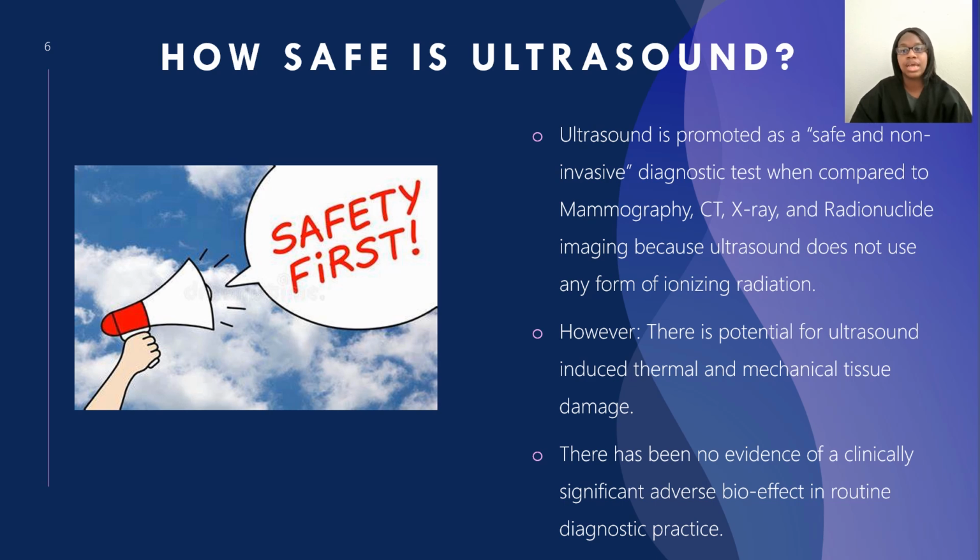Whenever it comes to ultrasound, ultrasound is promoted as a safe and non-invasive diagnostic test when it is compared with mammography, CT, X-ray, nuclear medicine, because ultrasound does not use any radiation. However, there is a potential for ultrasound-induced thermal and mechanical tissue damage, and that's why we want to make sure that we are checking the wires, checking the cables, making sure that the machine is functioning properly, performing the QA and the QC on the machine when needed.